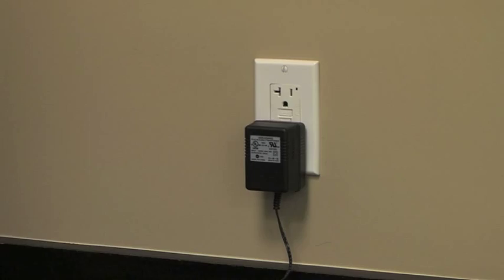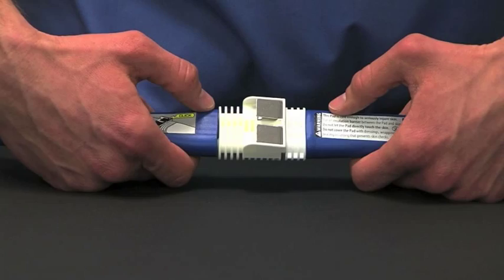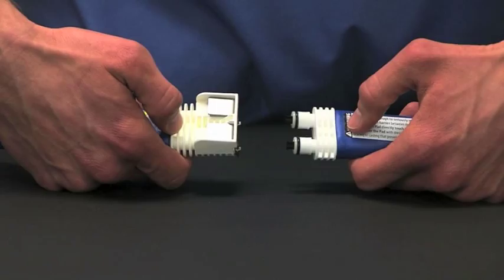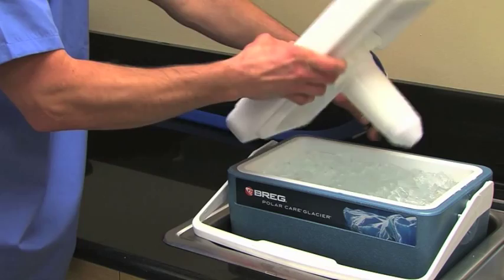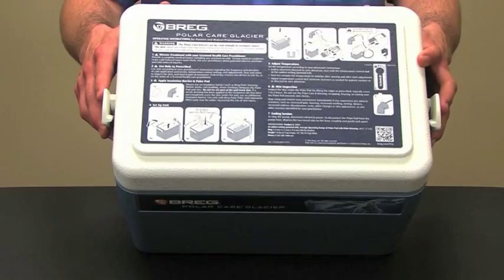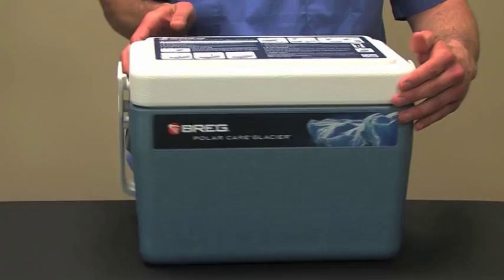To stop or refill the unit, unplug the unit from the electrical source. Disconnect the pad from the unit by depressing the two metal tabs and gently pull the connectors apart. The pad will seal itself and won't leak. Some dripping during release is normal. Turn the lid upside down and place it on a flat surface so extra water gathers in the lid, then refill the unit with cold water, then ice.